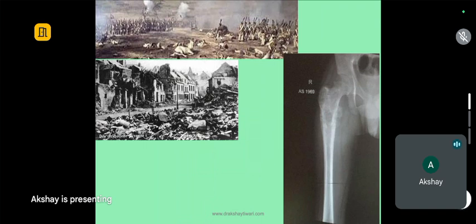No, now you cannot say where was the host country or the host army. Everything is they have just walked over the home territory. So this is a kind of lesion where you cannot find the home army. They have probably run away to other parts of the country.